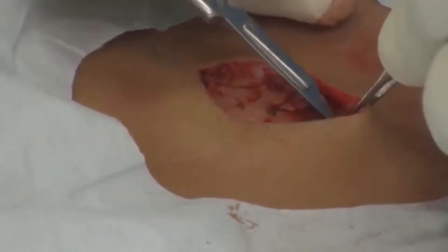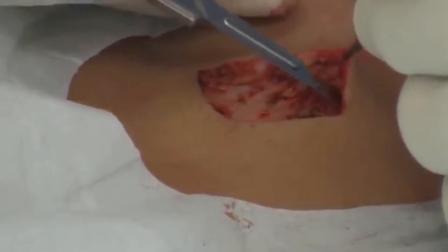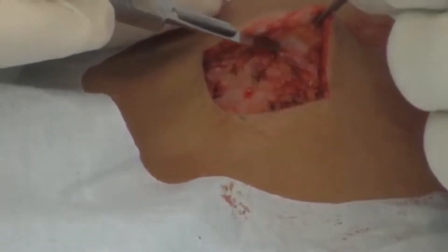Next, we will proceed with the undermining through the fat layer of the wound in order to bring the skin together without too much tension on the sutures. If the undermining creates additional bleeding, electrocoagulation is easily achieved in seconds upon contact of the A804 electrode to the bleeding point.